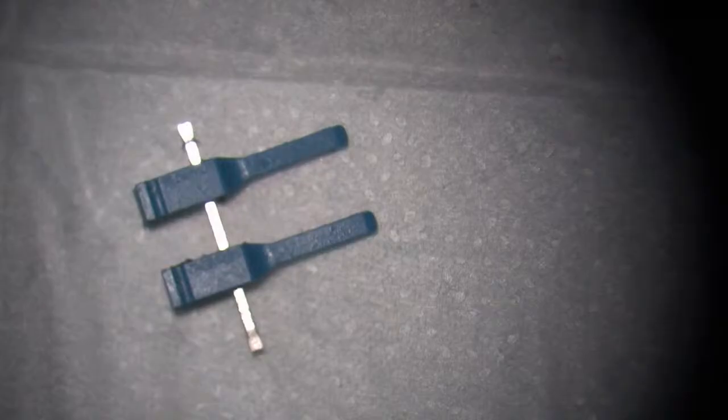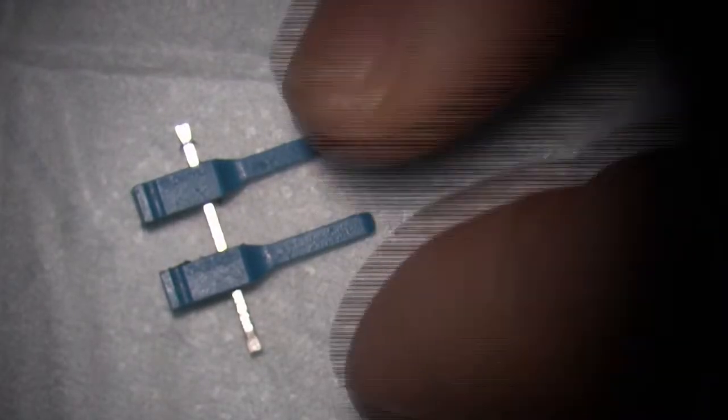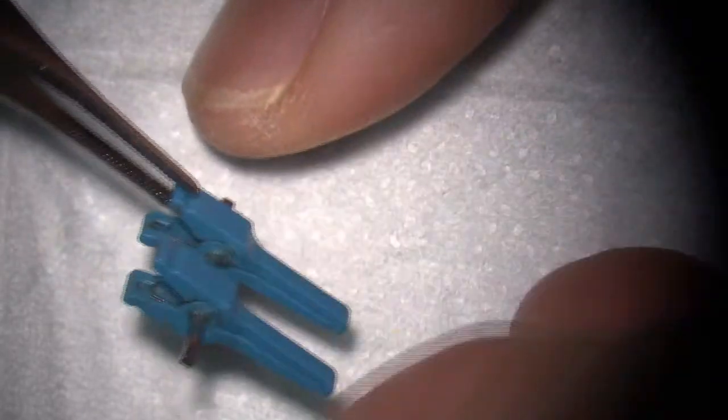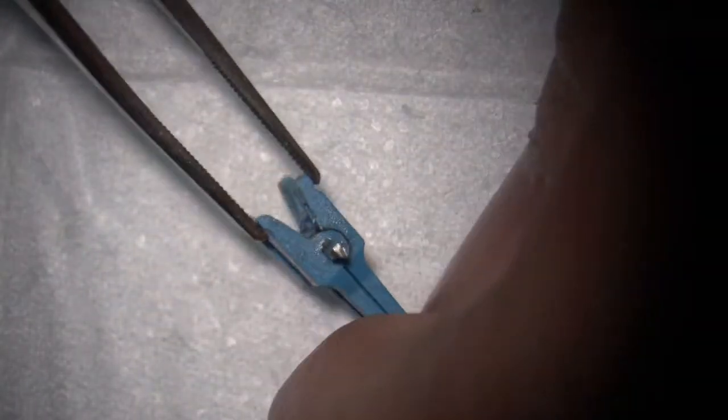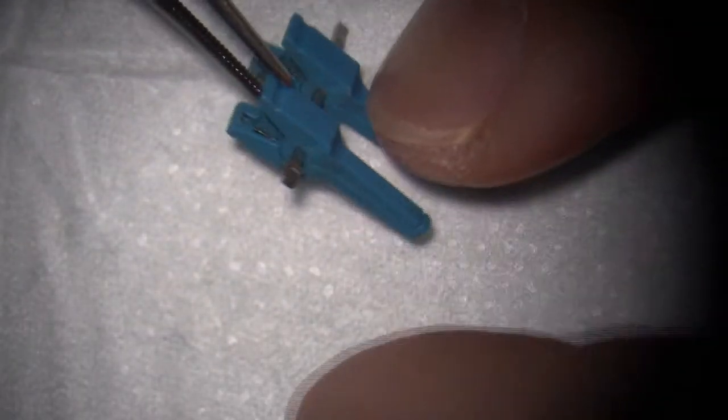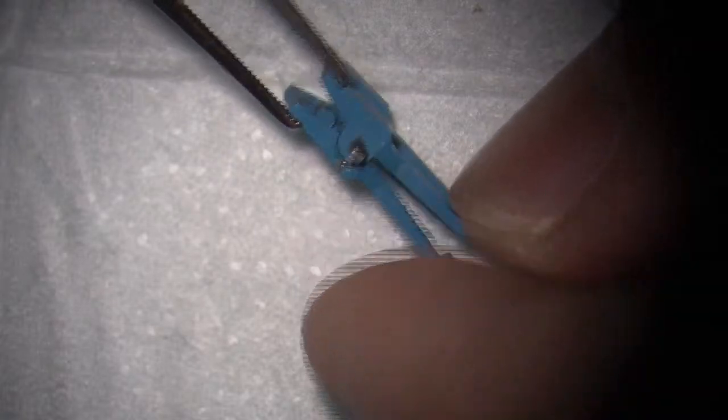See that? Sometimes it looks like the regular forceps, but it is used to clamp down the vessels when you're doing the anastomosis. It's kind of holding here. Look at here, you can see there's a groove. Some of the forceps for handling the clamp have a groove that matches the groove here, so they can hold it easier, handling the clamp, rather than sliding off with a normal forceps.